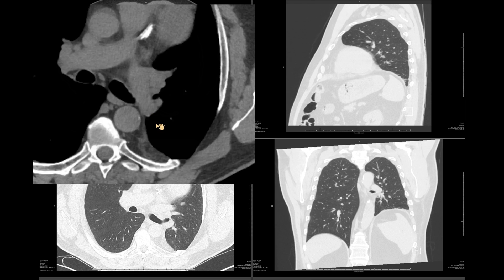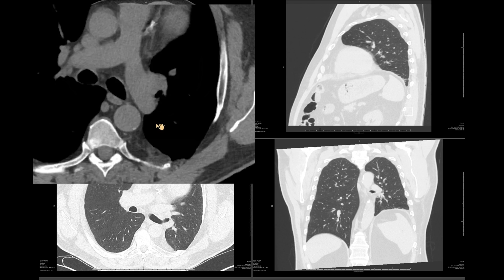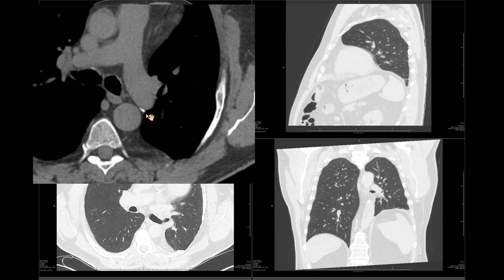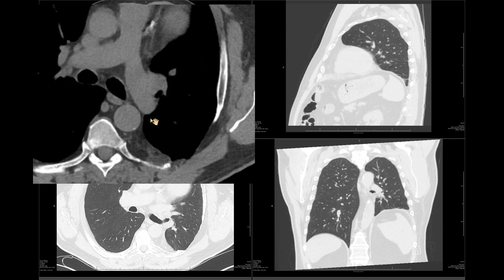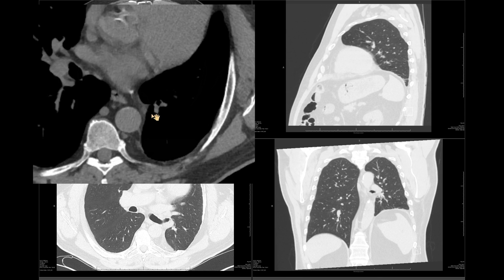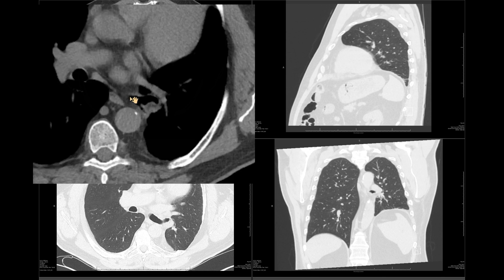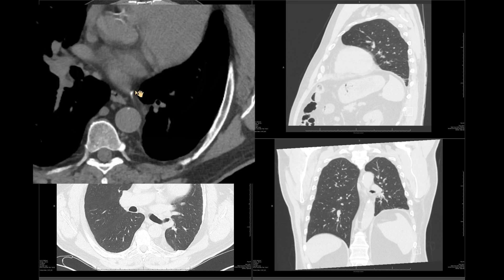The blood supply is straightforward: the left interlobar artery sends blood to the left lower lobe and also a couple of branches to the lingula. Venous drainage is via the left inferior pulmonary vein, and you can see the clip right there.